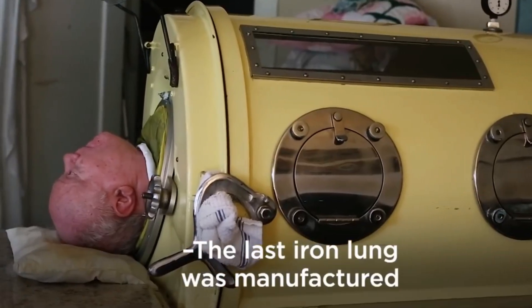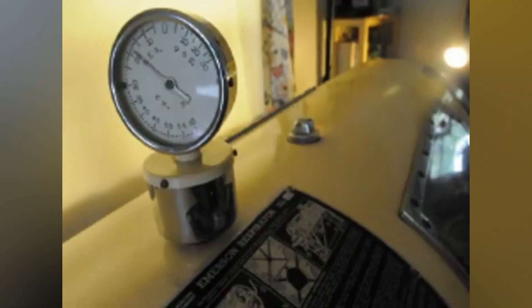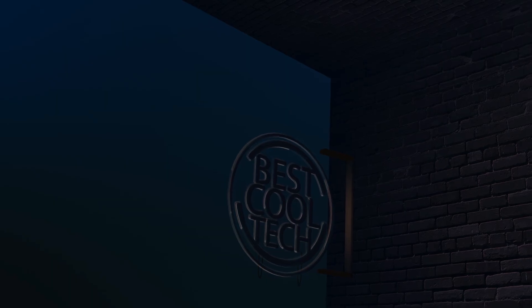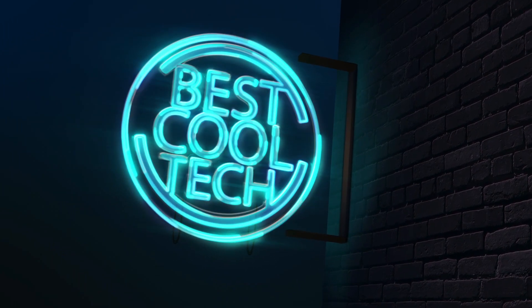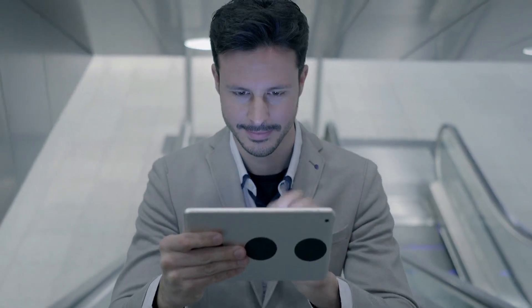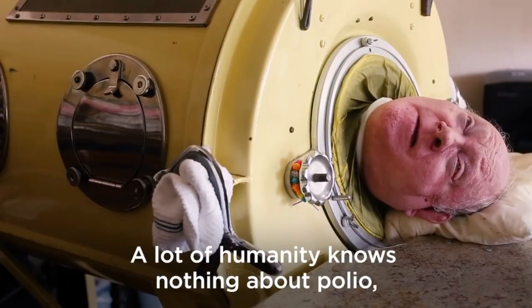The iron lung is such an amazing invention that needs to be looked into. How does it work? And what are the impacts it had on the lives of those who relied on it for survival? In today's video, we're discussing iron lungs, so sit back, relax, and prepare to be amazed by the remarkable reality of the iron lung. If you've never heard or know anything about this technology, you need to.